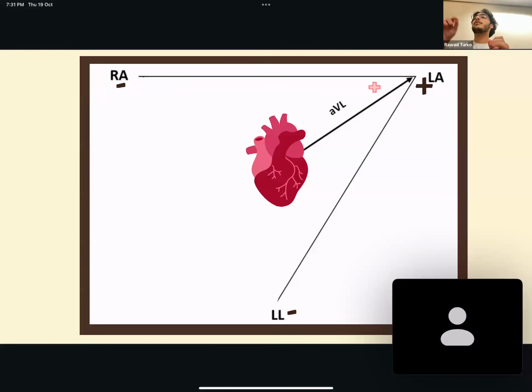So we're looking in from the left arm at the heart, if that's what you're asking. We're not looking in. So the arrow again. Maybe this diagram was a bit of a mistake, because I get that the arrow is pointing up at the left arm, but no, try to imagine the arrow this way. The arrow is just there to show you where the positive electrode is. So you mean our eyes are present at the left arm, positive side, looking towards the heart? Yes, exactly.